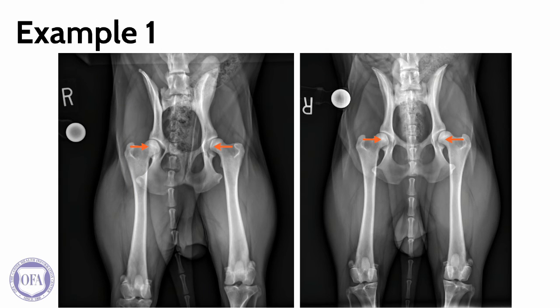On retake radiographs, the positioning of the dog has improved. The obturator foramen are closer in symmetry. This is still not 100% perfect, as the right obturator foramen is still very slightly larger than the left, indicating that the dog is still very slightly rotated towards the left. However, the spinous processes and os penis are in better alignment with the vertebral column.